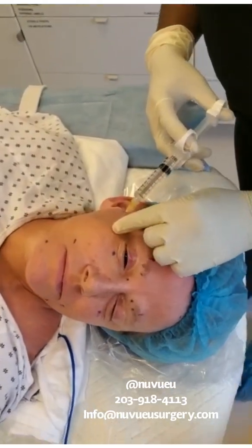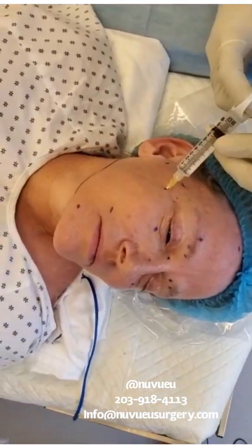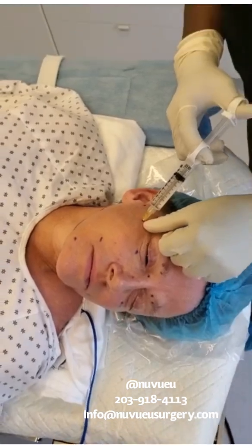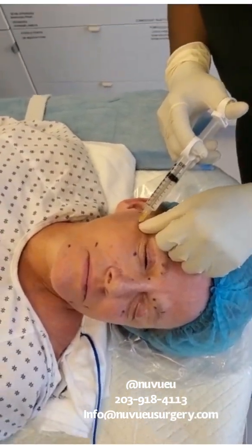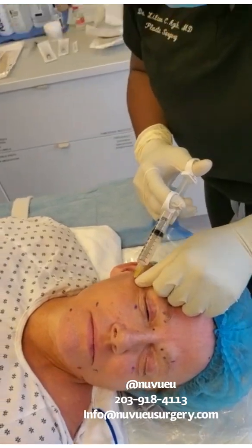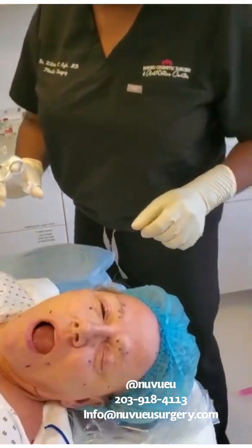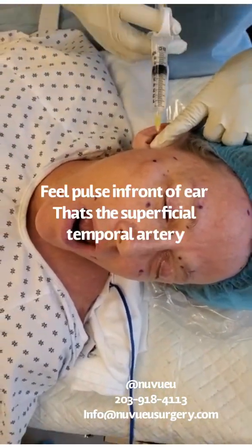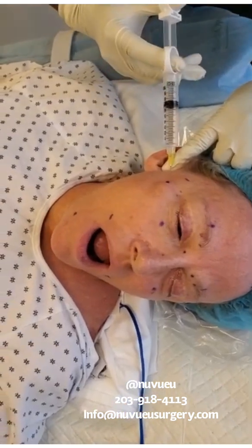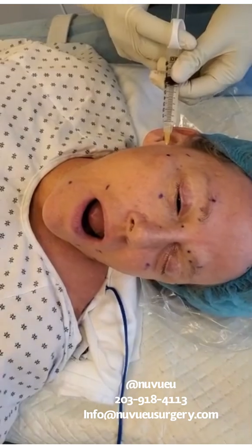The zygomatic facial — this is really nice because it blocks this entire area. Open your jaw. You feel and palpate for the artery, and you go right in front of the artery, all the way into that space. You aspirate to make sure you're not in the vessel.